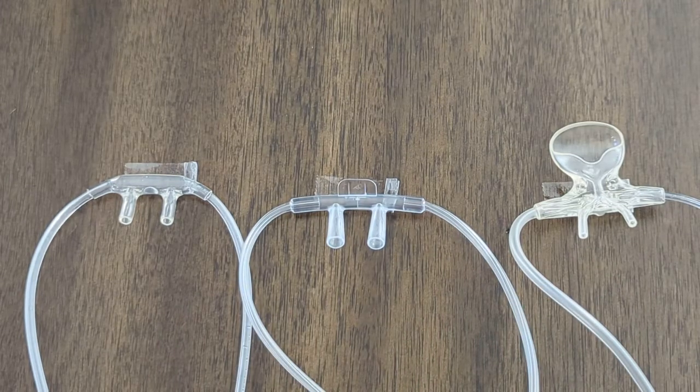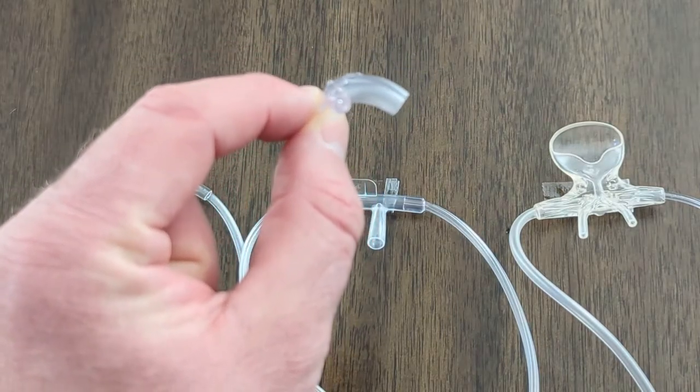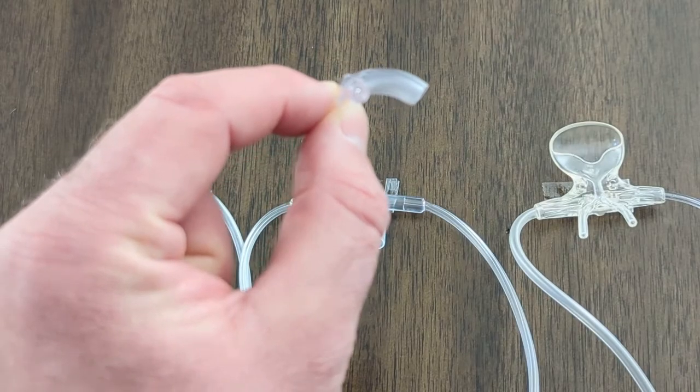The last thing is, I keep saying straight prong. Yes, there are different types. This is a curved prong. The purpose of this is to direct the oxygen flow towards the nasopharynx.